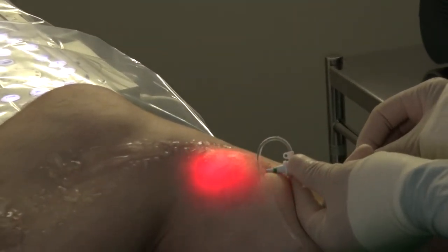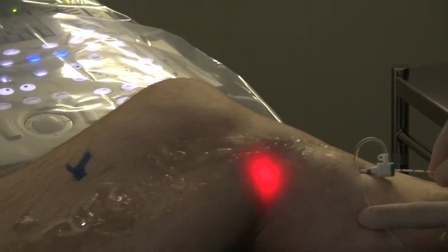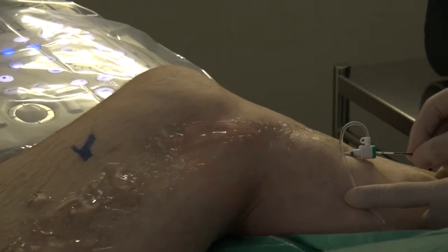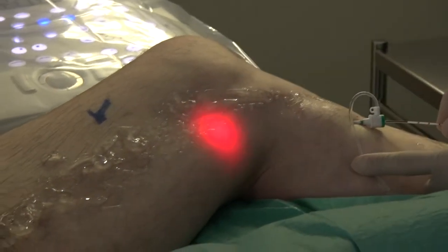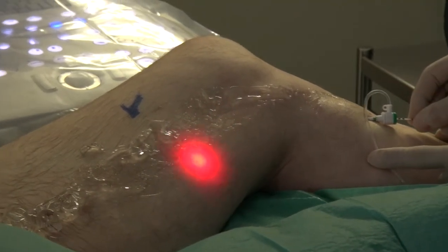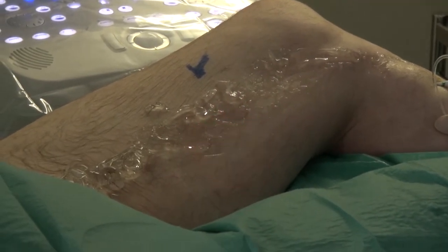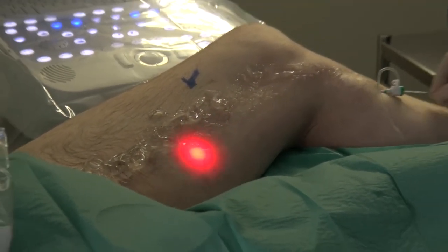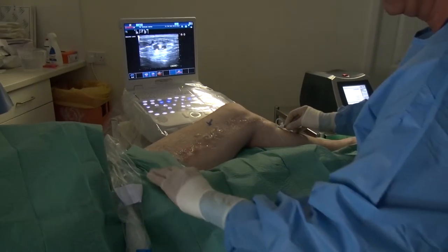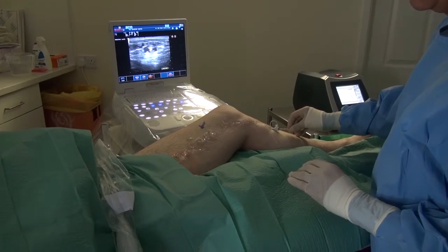The aiming beam allows us to follow the advancement of the catheter up the leg. The catheter is inside the vein and it's following the course of the great saphenous vein up the inside of the thigh underneath the skin, and we are watching it advance up the leg to where the great saphenous vein joins the femoral vein.